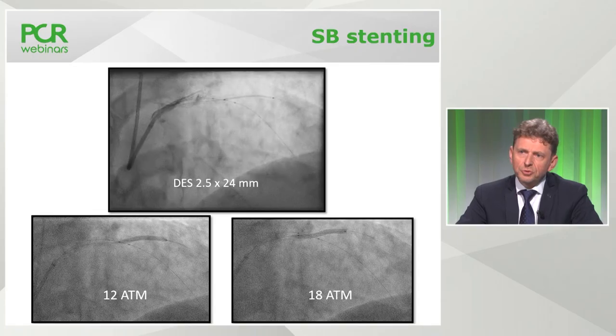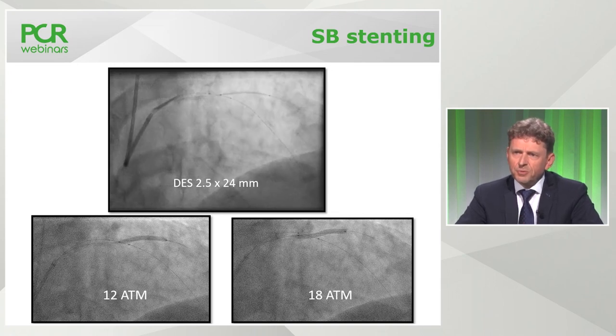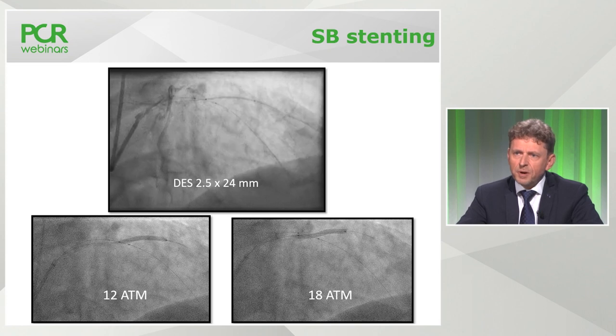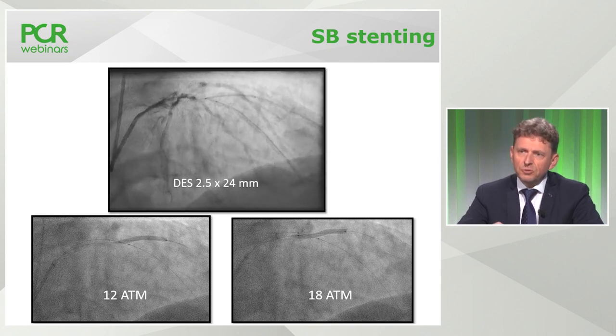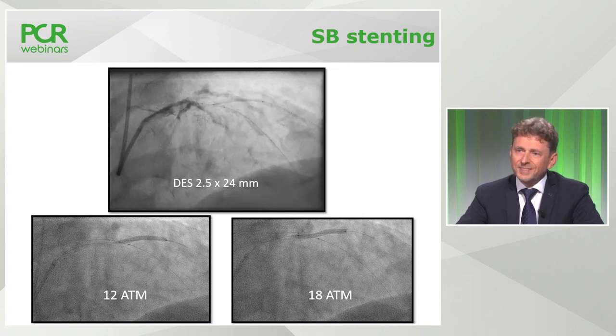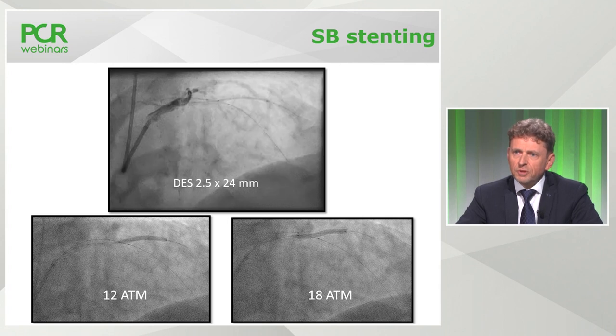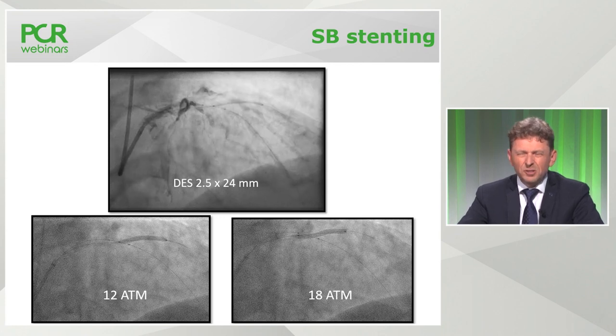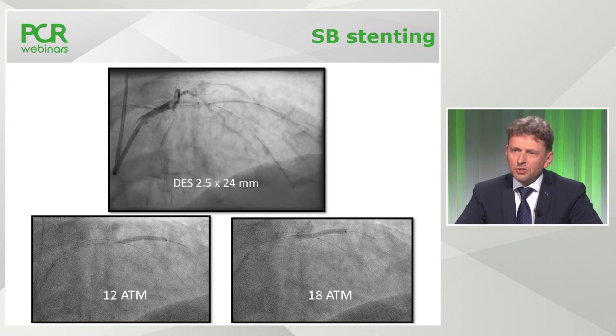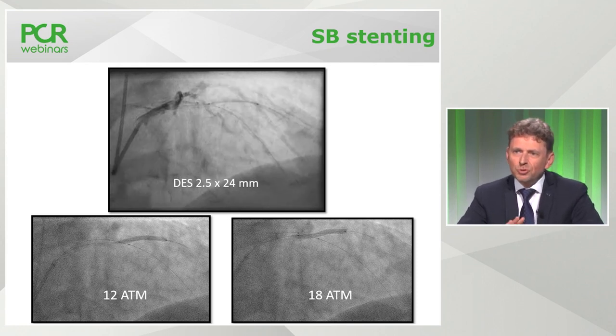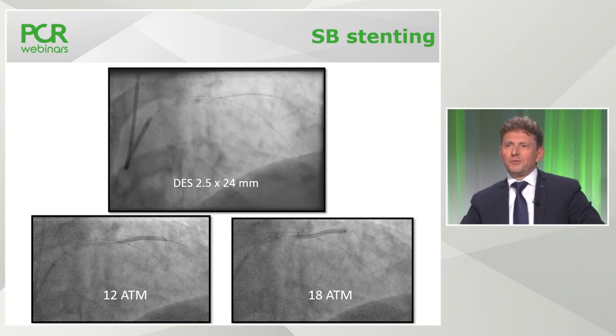Careful, adequate predilatation with non-compliant balloon — but carefully, not to create big dissections. The next step is side branch stenting. You see the side branch stent in position with some small protrusion towards the main vessel. A very important part of the procedure is that you need to have a parked balloon in the main vessel because you need to crush the stent just after implantation. You can appreciate the two balloon markers already parked. In most cases, we park the main vessel balloon at the level of the bifurcation — it's important not to be proximal.